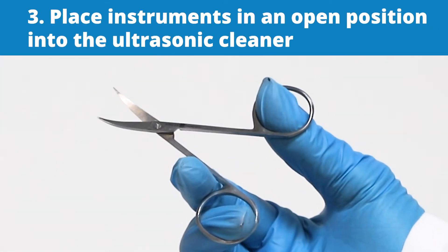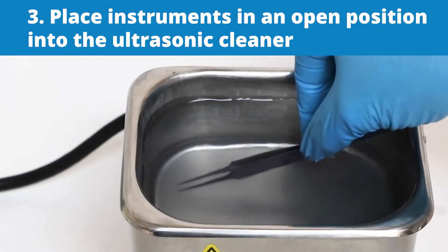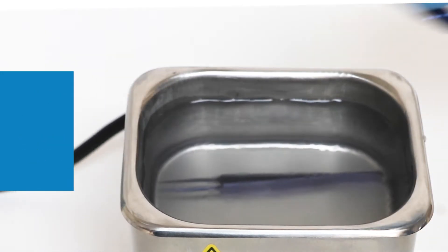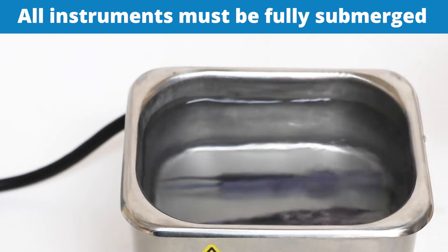Third, place instruments in the open position into the ultrasonic cleaner. Do not allow instruments with sharp blades to touch other instruments, and all instruments must be fully submerged.